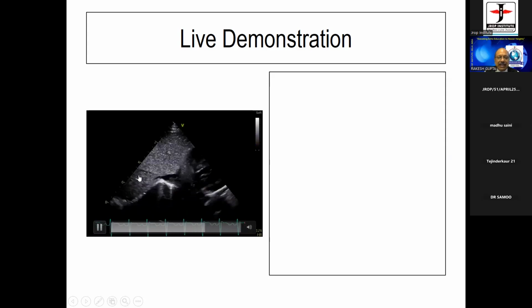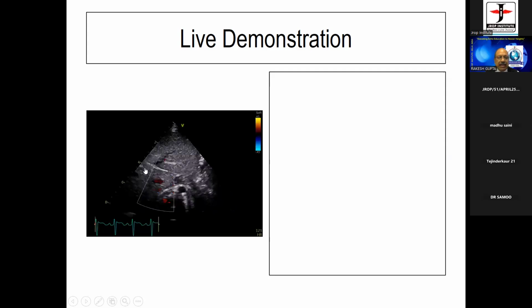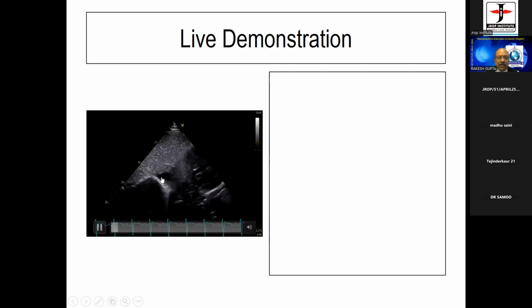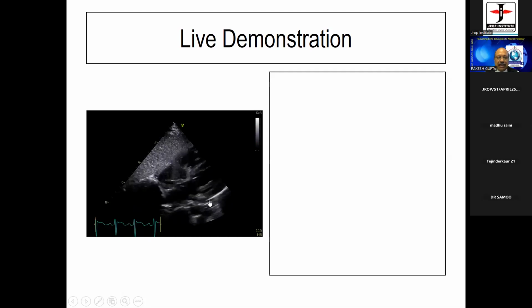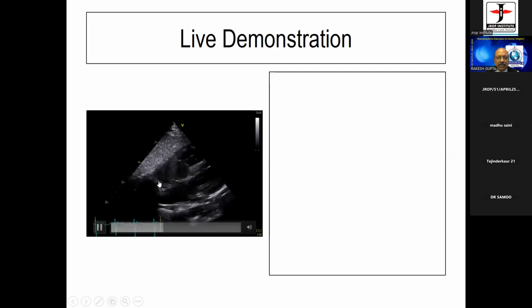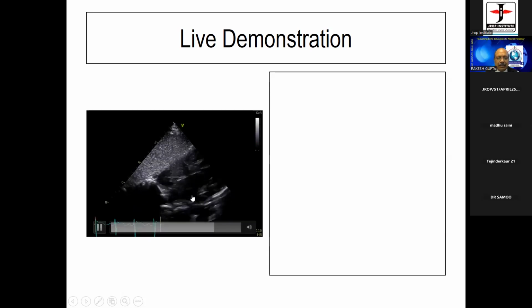And whenever this is seen, the IVC is opening into the RA. And that's the most important thing: the IVC which was seen at the transverse level, when we do anterior rotation, drains into a structure which is possibly a morphological RA. The other structure is the morphological LA, and we have to prove whether this is a morphological LA or not. Now look, this is a static image. Here is the IVC, here is a morphological RA, here is a morphological RV, morphological LA.